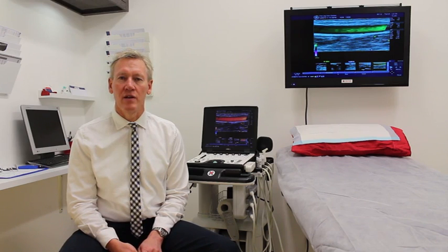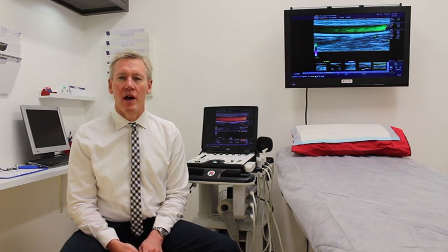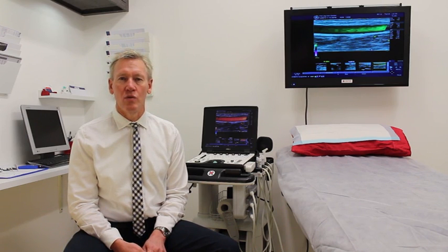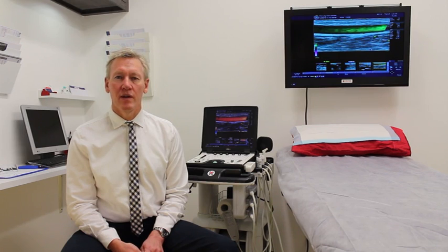It is the saphenous vein which is large and hidden and it is failing. Saphenous comes from an old Greek word meaning hidden. With ultrasound we can see that vein. We can test it. Normally it is about 3 to 4 mm in diameter.